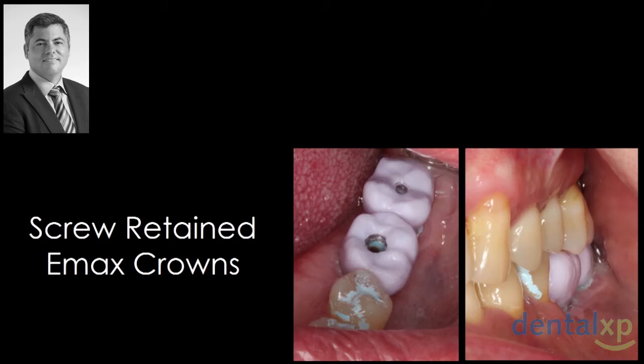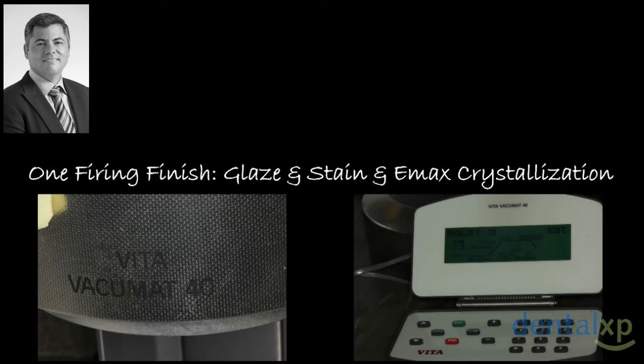And one of the reasons why I like to bring this guy on is because when you work with this type of technologies, yes, you're going to get a crown that is going to fit. You're going to get a crown that is going to have whatever anatomy that you have virtually designed. But one of the big problems is that what takes the longest time is adjusting the different shades and the different colors to get good cosmetics, to make these ceramics look good. And that can take you a full afternoon just adjusting the colors. And really, it defeats the whole purpose of milling in your own practice.